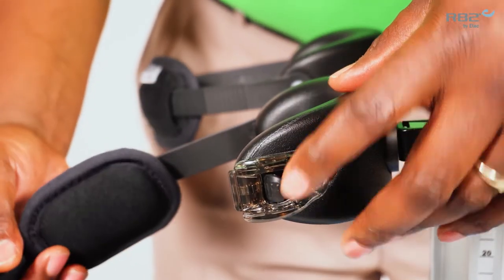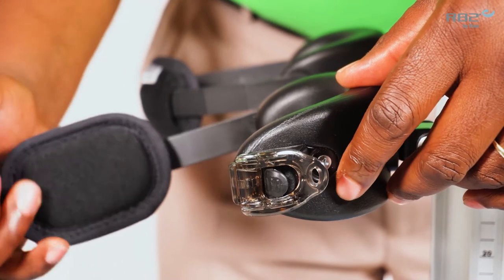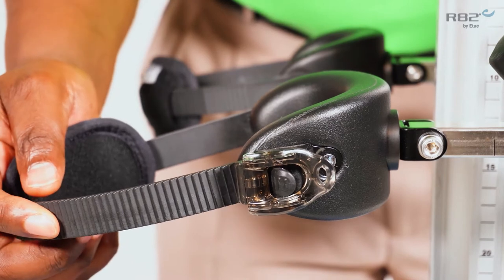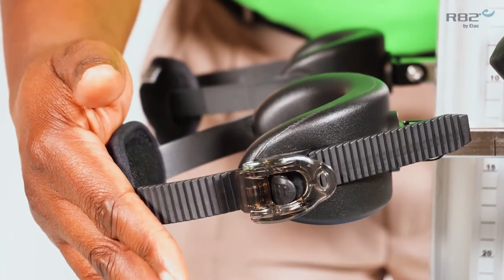The knee pad has a unique ratcheting system. There are two ways to use the ratcheting system. One is by inserting the strap for the knee pad and pressing in.